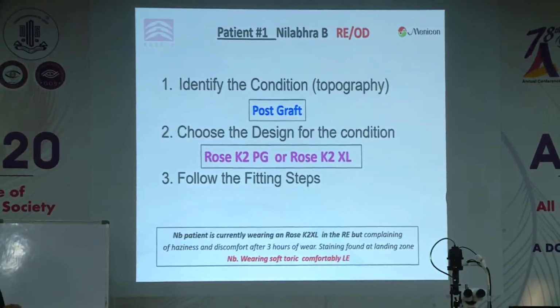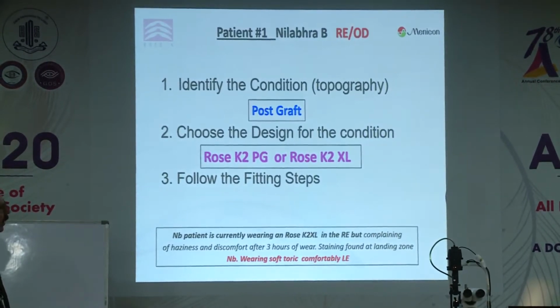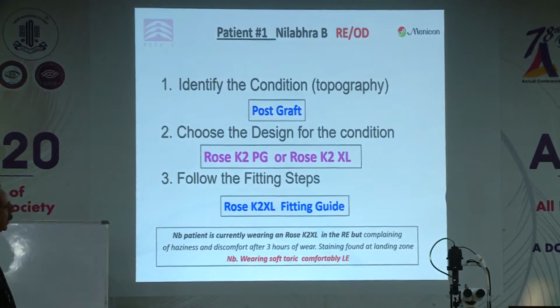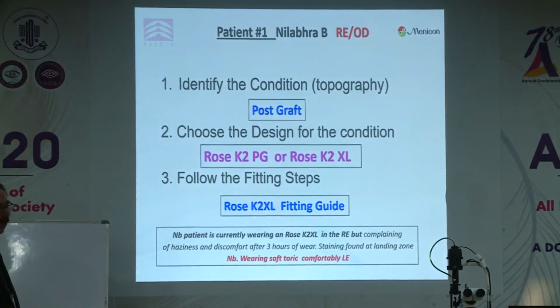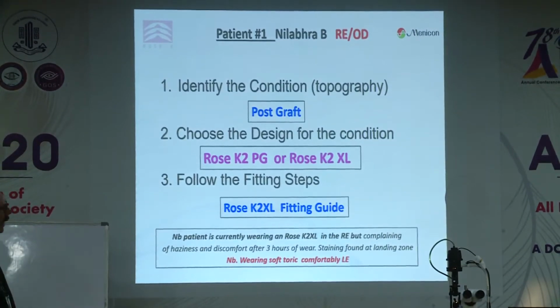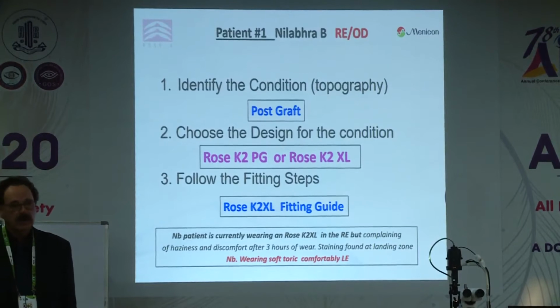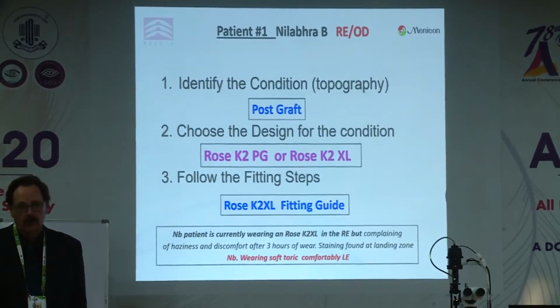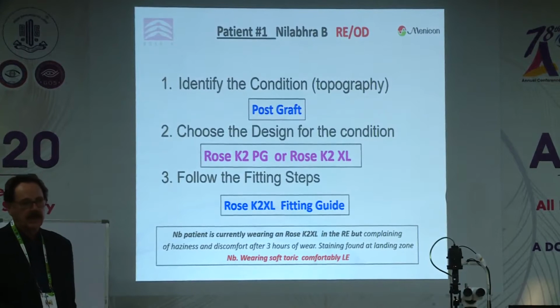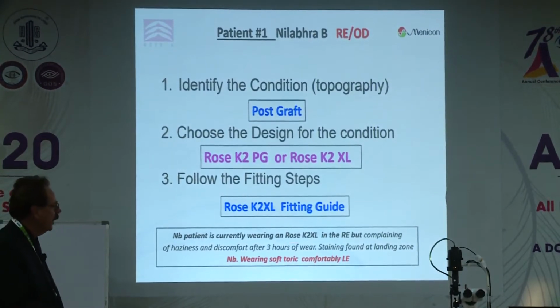You're going to choose either one of those two designs, but Monica has tried this and he didn't tolerate it well. So we're going to go to the XL design, which is more easily tolerated. And you go to the Rose K2 fitting guide, which you can get from the distributor. Also, the choice of making that was he's comfortably wearing a soft lens in his left eye. If you try to fit him with a corneal lens in his right eye, he will not love you very much at all. He'll probably be unsuccessful tolerating a corneal lens in his other eye because his left eye feels so good.